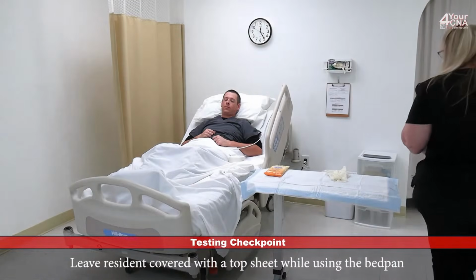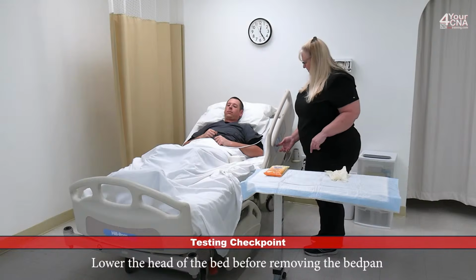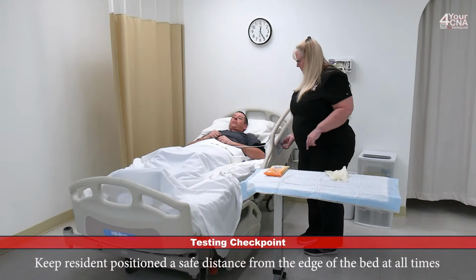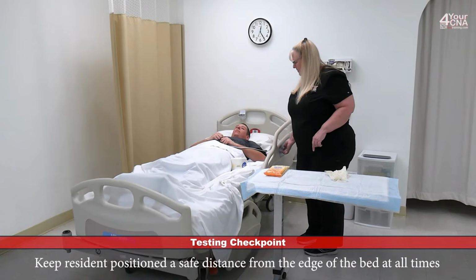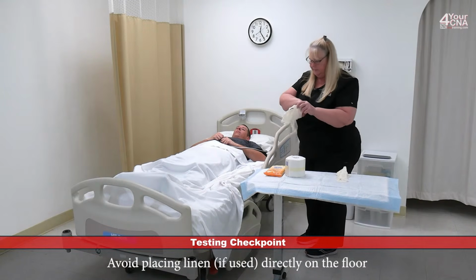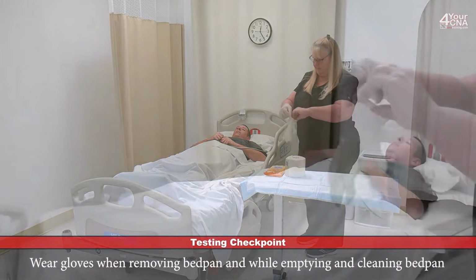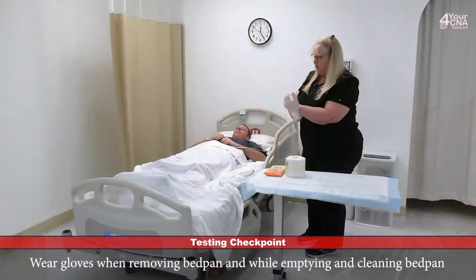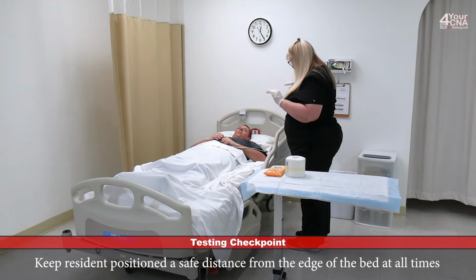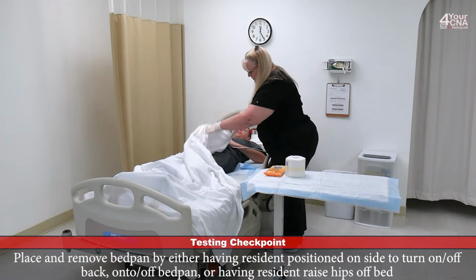Okay, Mr. Jones, are you done? I am. Very good. Let me lower the head of the bed. There we go. And I'm going to put my gloves on. All right, Mr. Jones, in just a moment, I'm going to ask you to bend your knees and lift your hips off of the bedpan, but wait until I tell you because I need to hold that bedpan flat. Okay? I'm just going to move this out of the way.